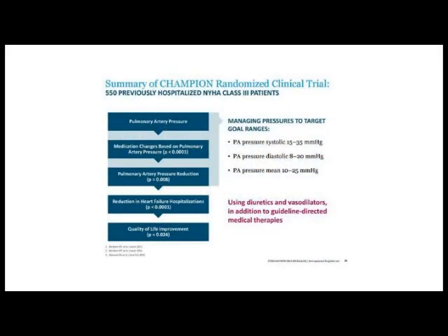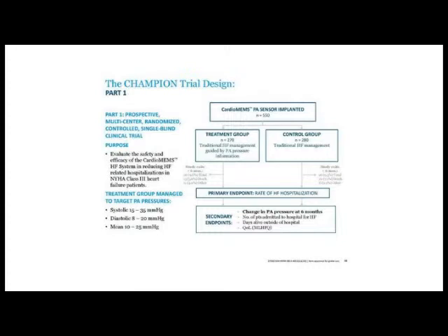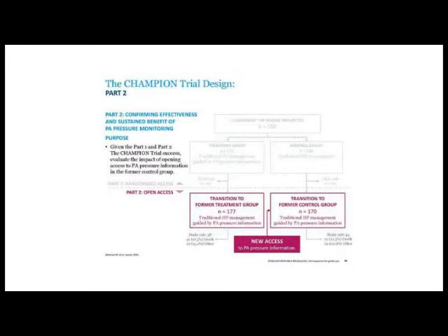There's been the major study that was done to look at this device initially. It's called the CHAMPION Study, and basically they randomized patients to receive this device and have monitoring through the device, or the control group where you don't get monitoring through your device, and patients are placed on guideline-determined medical therapy for their heart failure. So treatment group and control group, and the primary endpoint was hospitalizations for heart failure. They looked at some other endpoints, like what the pressures actually were, and quality of living scores, things like that. Later in the study, they transitioned some of the patients who had been in the control group to have active therapy with the device.